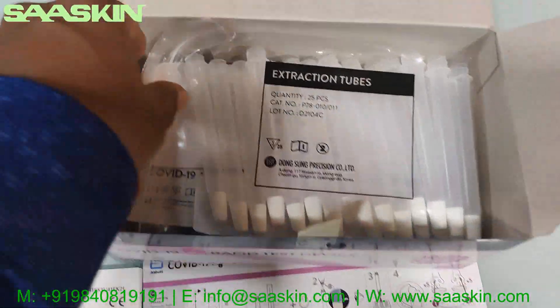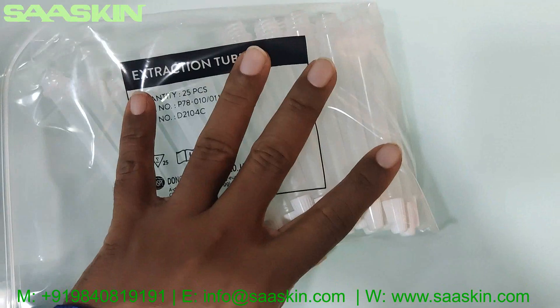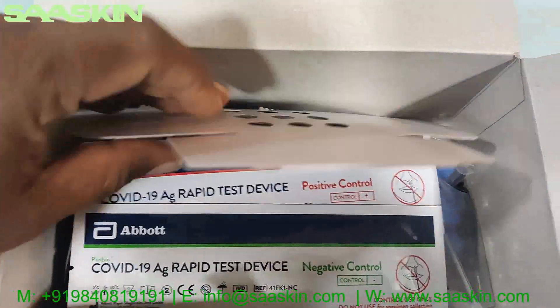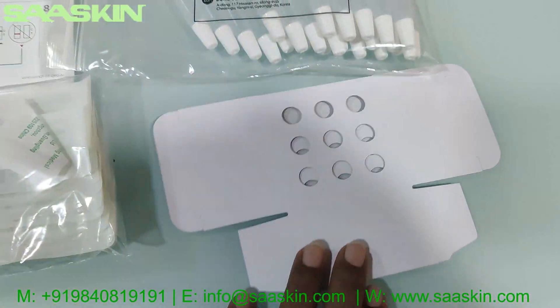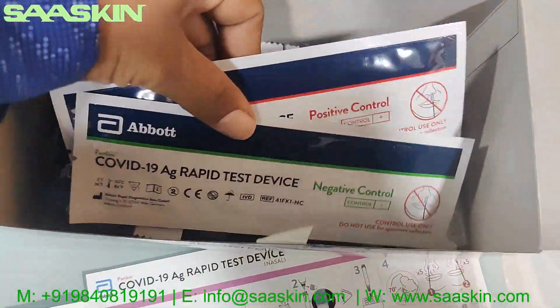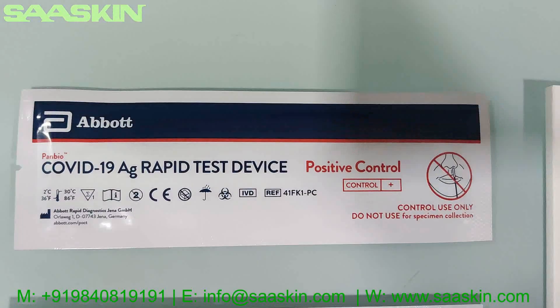You can see the 25 extraction tubes here. You also have a cardboard-type tube stand, and there are positive and negative control swab sticks included.